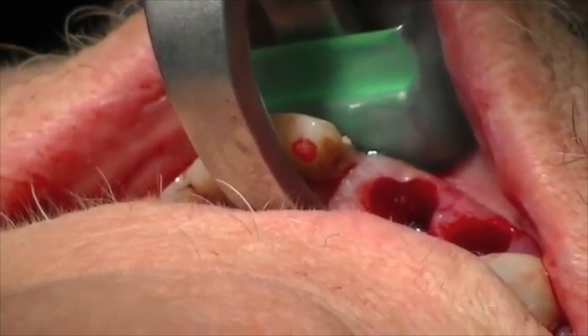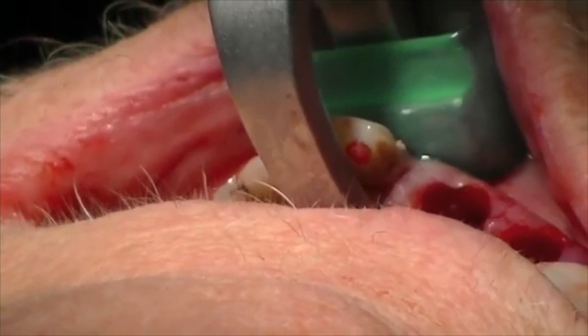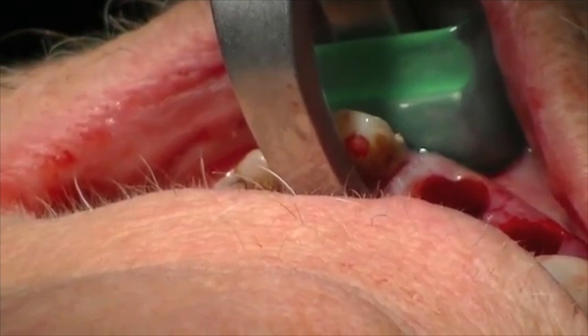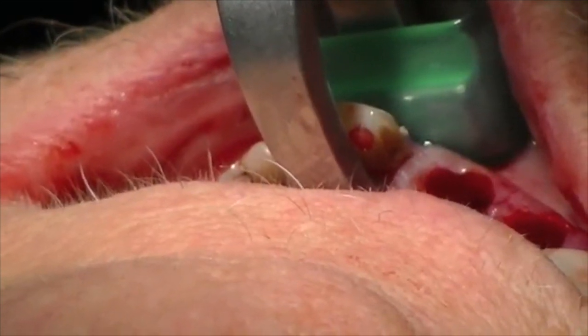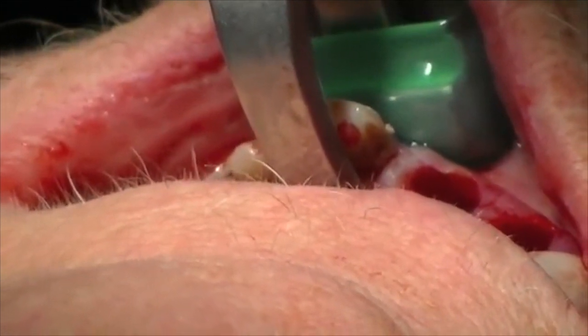It may take two, three, four minutes for this to be removed. And as dentists, we like to rush — you can't rush it, and you can't use it like a conventional forcep. So I'm just doing constant rotation of my wrist, and you'll see the tooth pop.